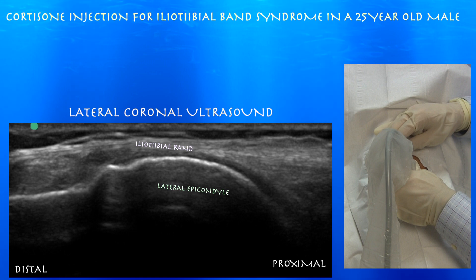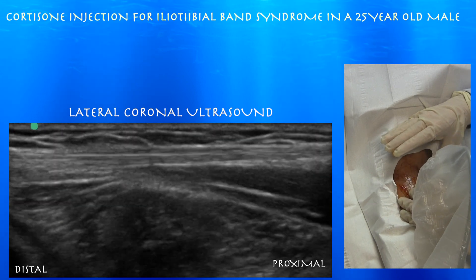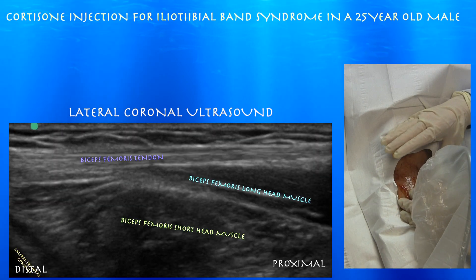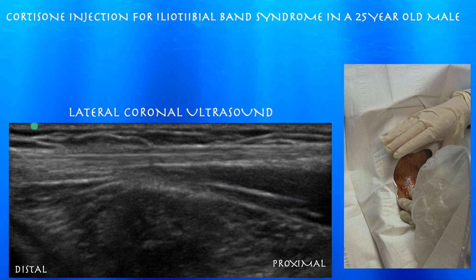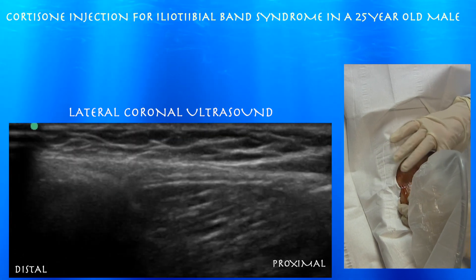Here you can see how the iliotibial band runs right on top of the lateral epicondyle. Now looking at the biceps femoris muscle tendon — here we are on some of the distal hamstring musculature. You can appreciate the biceps femoris long head musculature and the biceps femoris short head musculature underneath that.